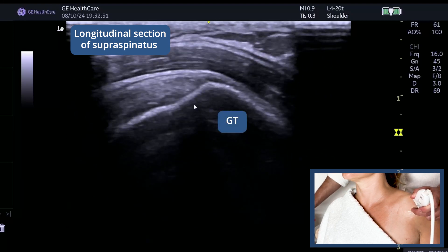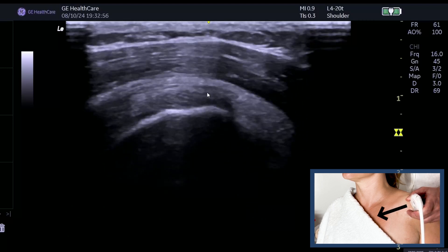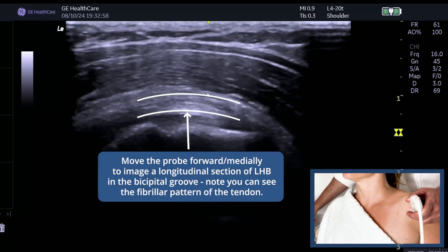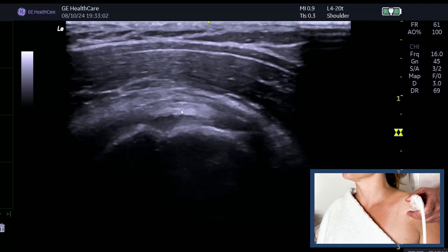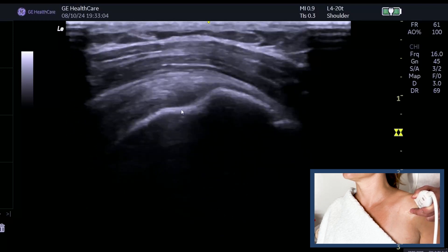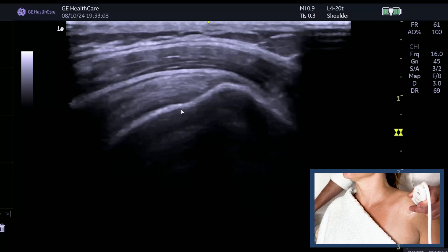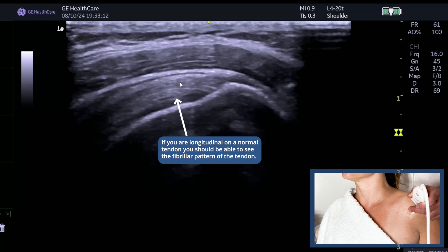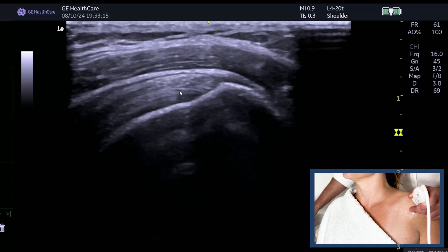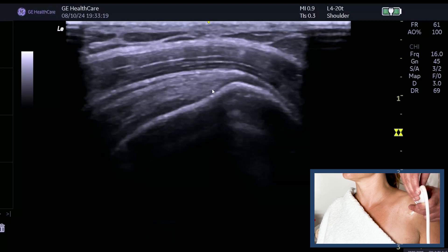Here are a couple of tips for the long axis view. This is supraspinatus in long — this is the greater tuberosity. If I push my probe forward, I am now long on the long head of biceps, which means when I come laterally I'm going to be truly long on supraspinatus. On a normal tendon in long you should see nice long fibers attaching in.